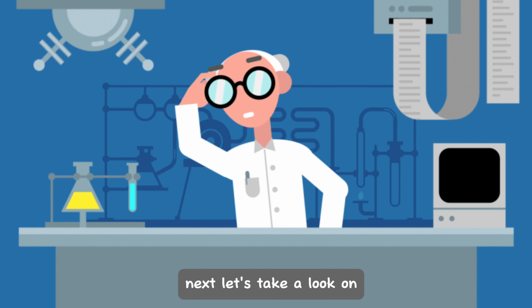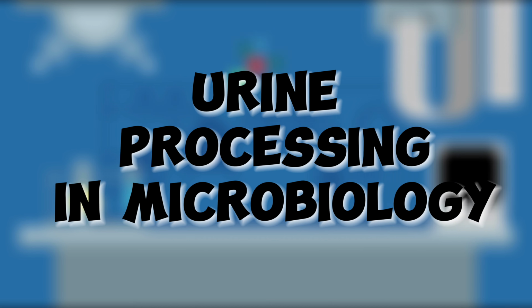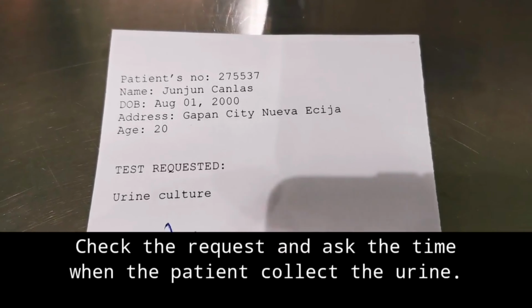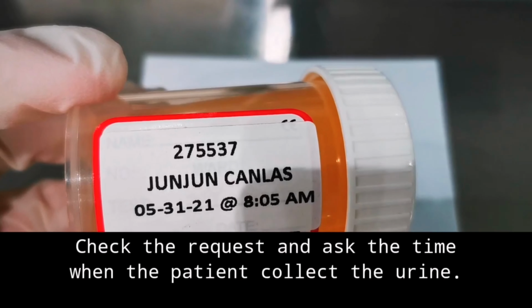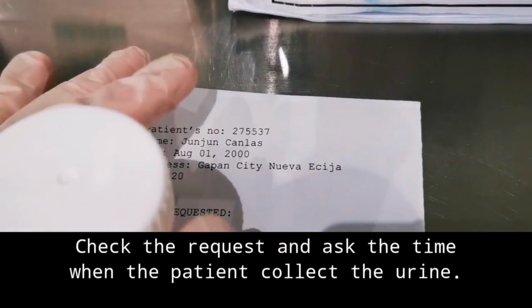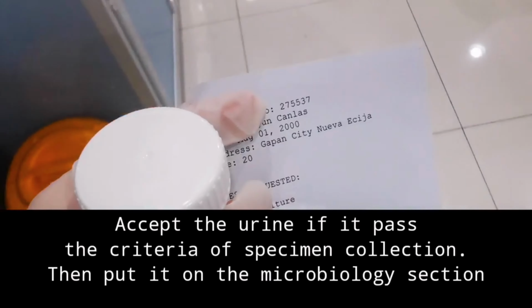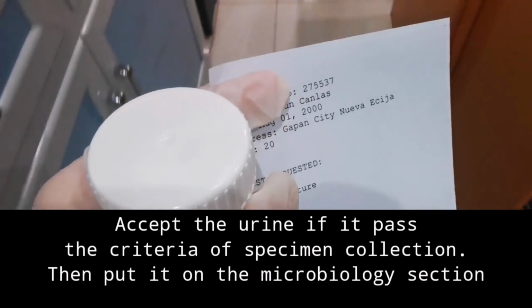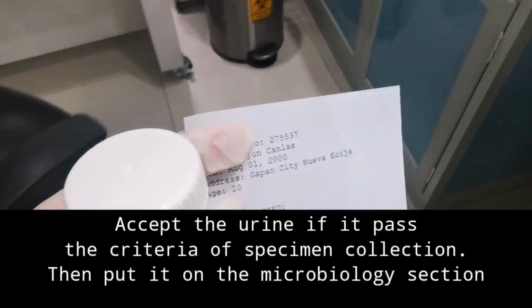Next, let's take a look at urine processing in microbiology. Once the urine samples reach the lab, make sure to check the request and ask the time when the patient collected the urine to avoid any potential discrepancies in the testing process. Accept the urine if it passed the criteria of specimen collection, then put it on the microbiology section.